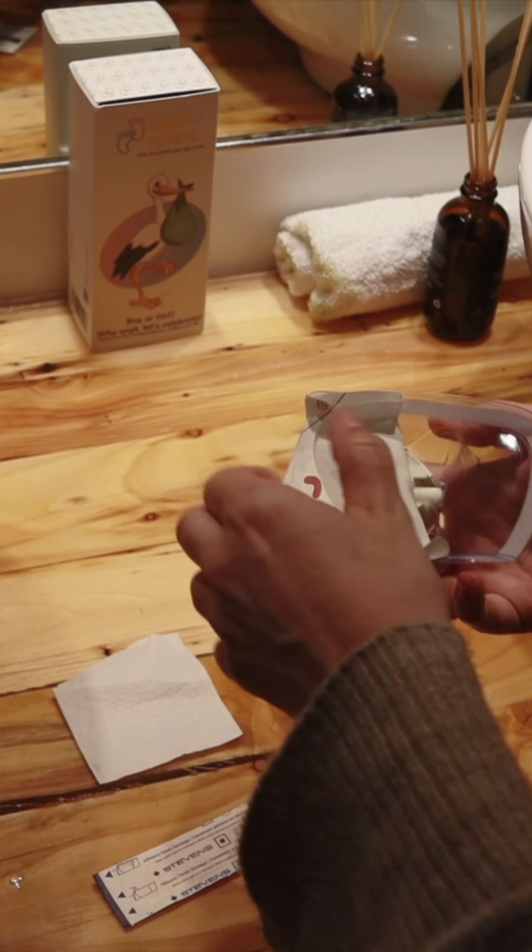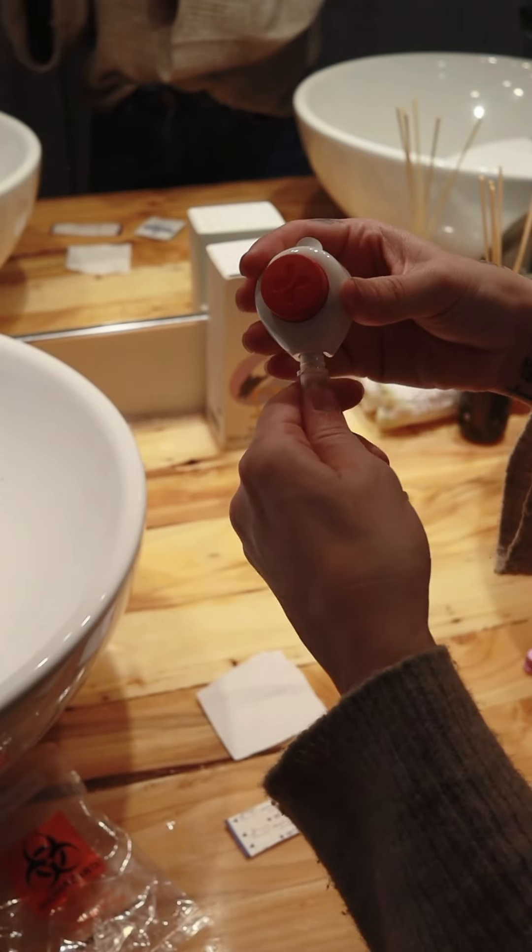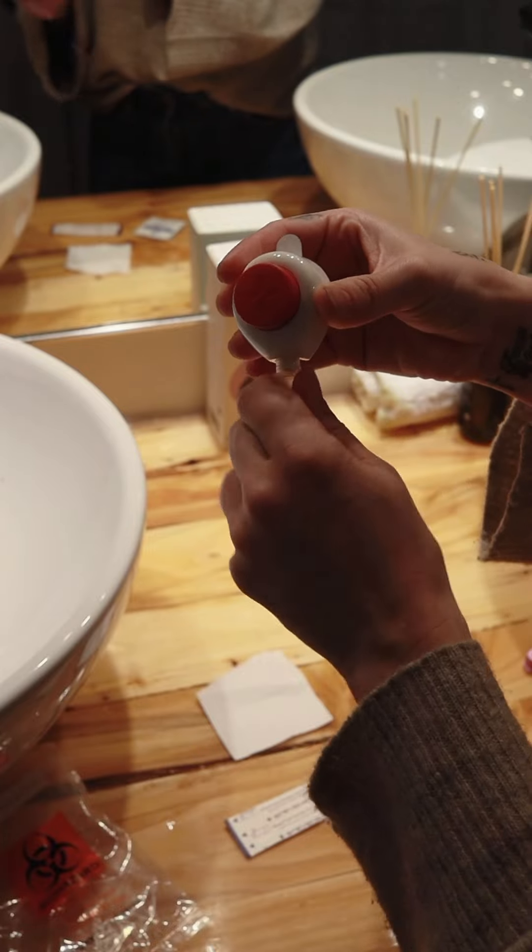Remove the device from its packaging. Then, remove the cap from the collection tube and insert the tube into the device, making sure everything is tight.